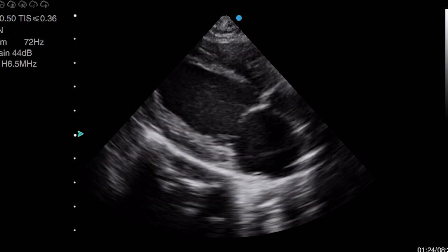The things we're going to look at in this video are bringing your image on axis. On axis means that the walls of the left ventricle should be like this on your screen, not like this. So we'll look at how to get an image that does look like this and bring it on axis like this.